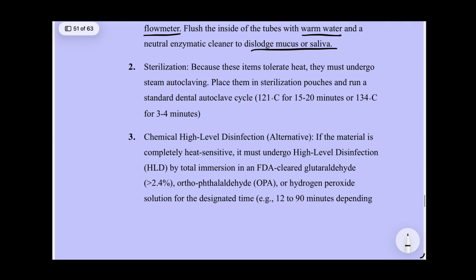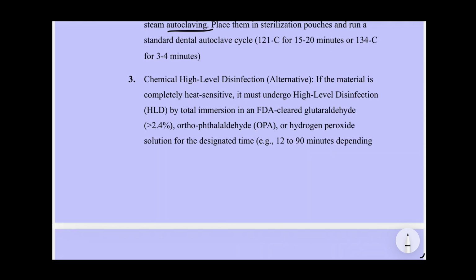And then sterilization. Because these items tolerate heat, they must undergo steam autoclaving. Place them in sterilization pouches and run a standard dental autoclave cycle. Chemical high level disinfection.